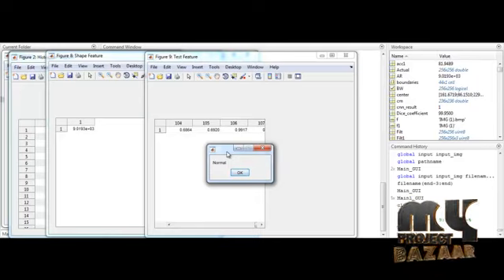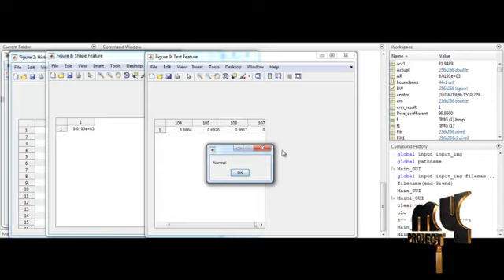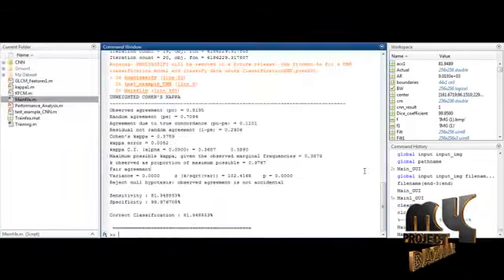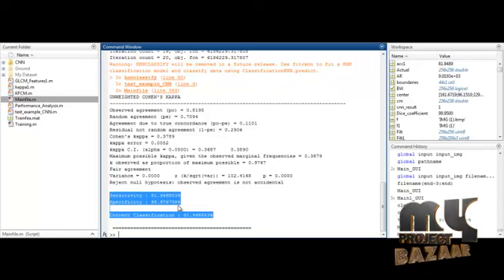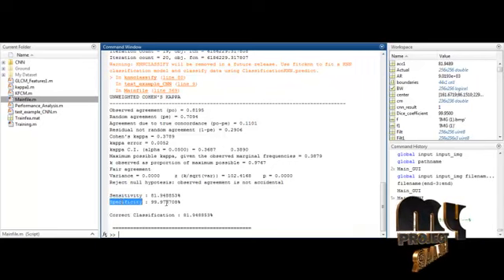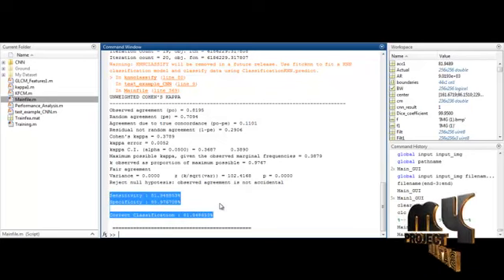If the input cell is a normal cell, the image will be displayed like this, with a normal message box. Otherwise, if the input is abnormal, the message box will be displayed as abnormal. At last, the performance will be evaluated and the performance metrics will be displayed in the command window. The correct rate, sensitivity and specificity values will be shown in percentage in the command window.